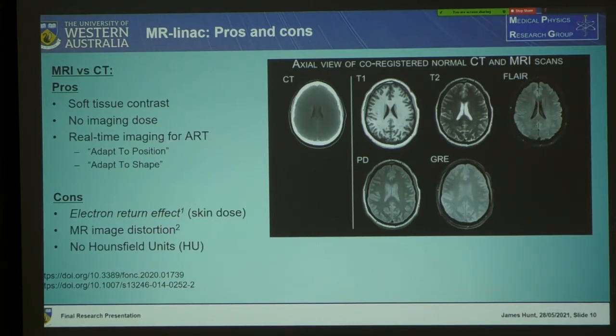So in Denmark, Hans told me all about their treatment plan, their daily treatment. They have trialed either adaptive position radiotherapy, where they keep the target volume shape the same, but they move it based on their imaging of the target. They also have adaptive shape volume targeting, where basically each day they're imaging the target volume, they are adjusting the shape of their treatment, and then they're targeting. So that one takes longer to compute, though the patients reportedly all tolerated that time really well. So there are options for intrafraction treatment, as I mentioned.